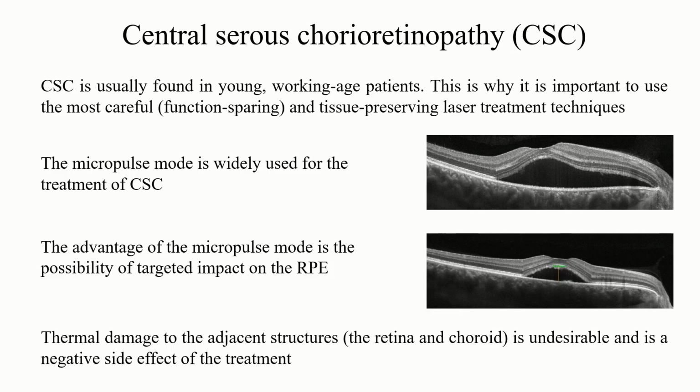The Micropulse mode is widely used for the treatment of CSC. The advantage of a Micropulse mode is the possibility of targeted impact on the RPE. Thermal damage of the adjacent structures, the retina and choroid, is undesirable and is a negative side effect of the treatment.